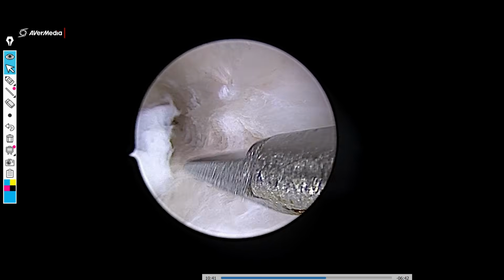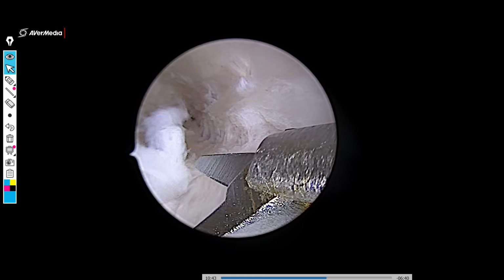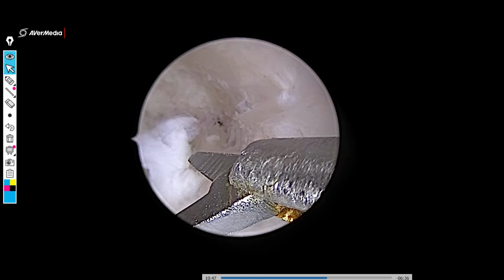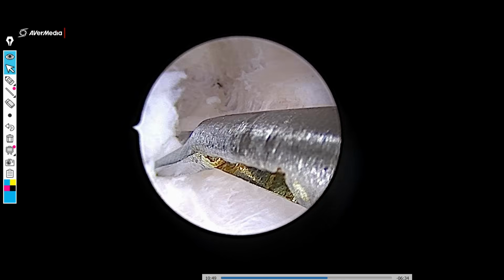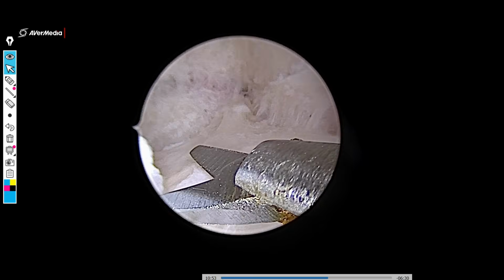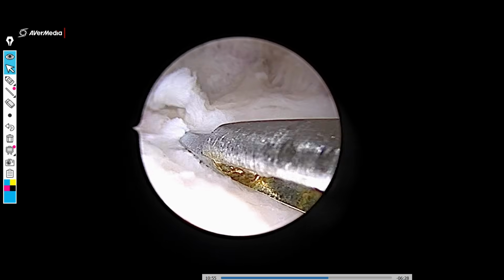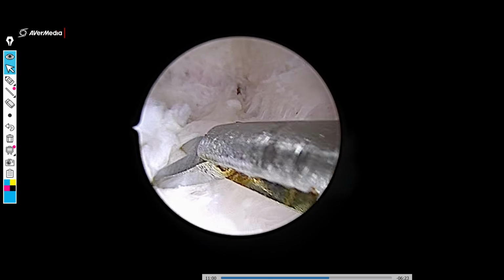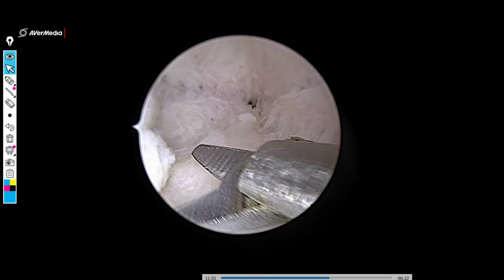Here, this is a block of tissue which majorly consists of fibrous tissue. And time and again, I have talked about doing excision of synechia rather than only incision of synechia, so as to not leave a stub of fibrous tissue behind, and to take out all the fibrous tissue that is there in that area, so that the patient has the best chance of conception.